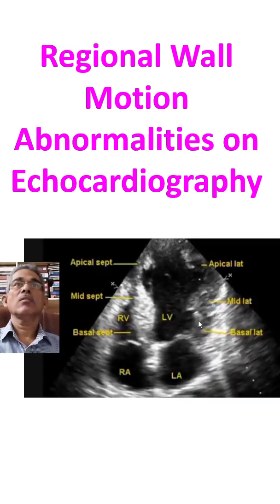And now we are into the apical four-chamber view. The segments you can see: this is right atrium, left atrium, right ventricle, left ventricle.